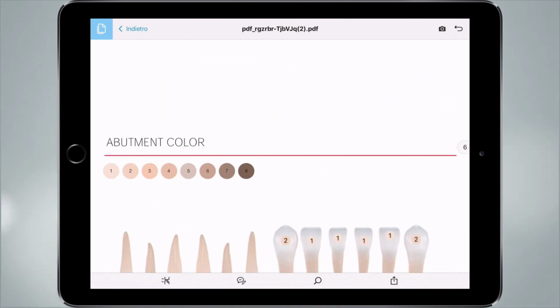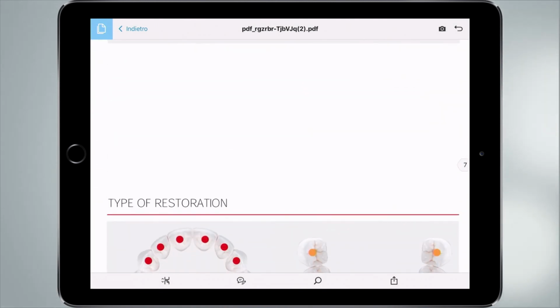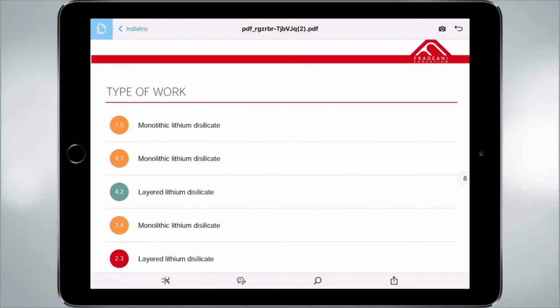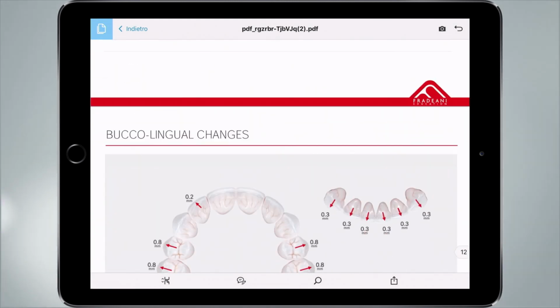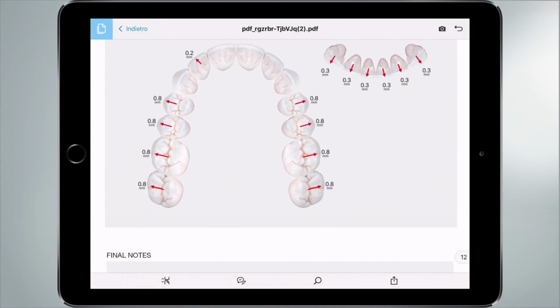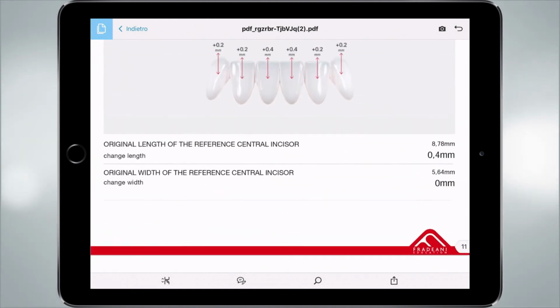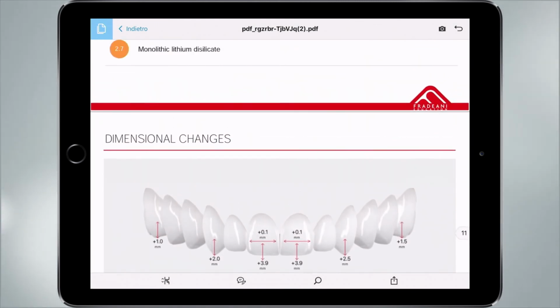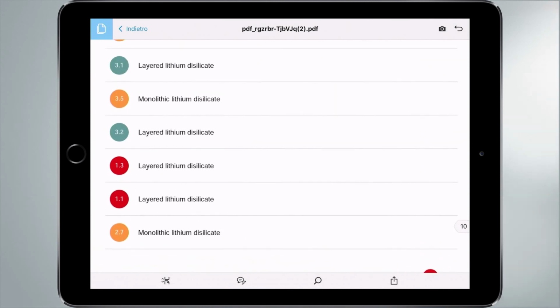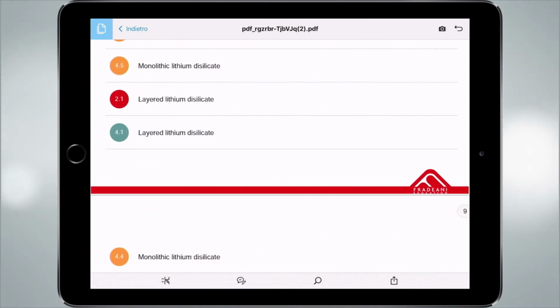So he can of course call you back or send an email or have some chance to communicate with you in order to have maybe some changes if needed, but of course 99% of the process is already done. Without any doubt, we have facilitated incredibly the work of our dental technician and also of our colleagues that help us during the day, every day in our office in order to finalize the case in the perfect manner.